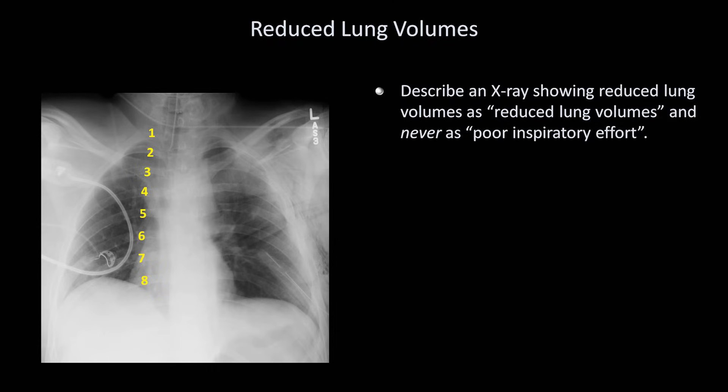The reason for this is that as the x-ray interpreter, unless you were physically present when the x-ray was taken, you have no idea what the patient's inspiratory effort was like. Low lung volumes may be the first sign of otherwise occult disease of the lung interstitium, the diaphragm's neuromuscular apparatus, or thoracic wall. Mislabeling this x-ray as poor inspiratory effort risks missing an opportunity at an early diagnosis of these conditions.